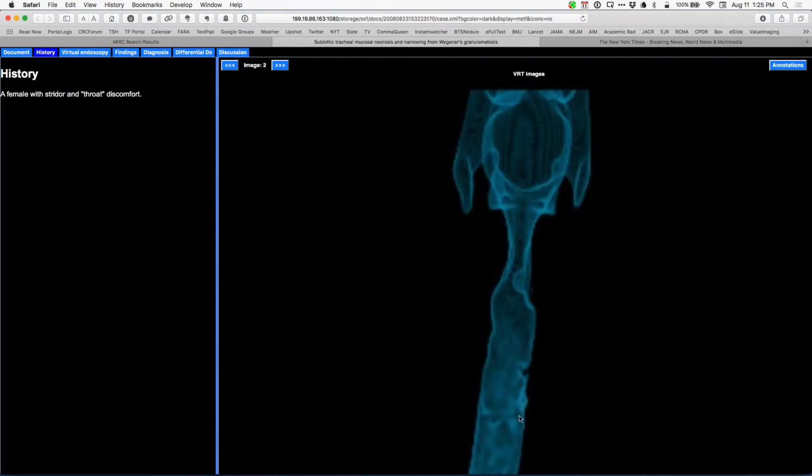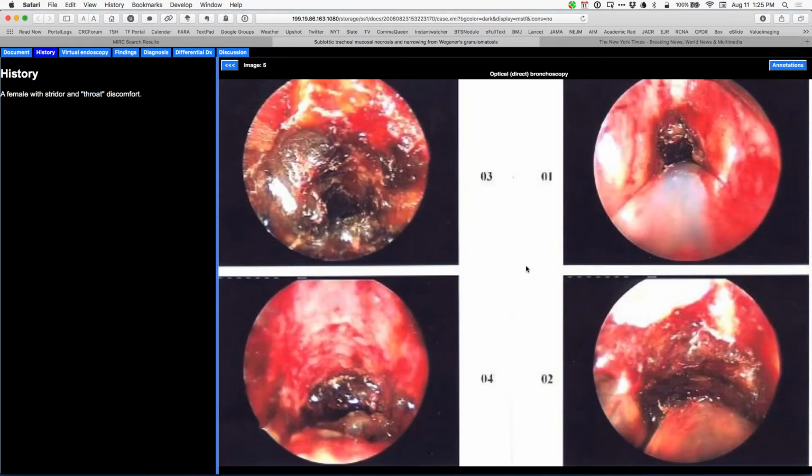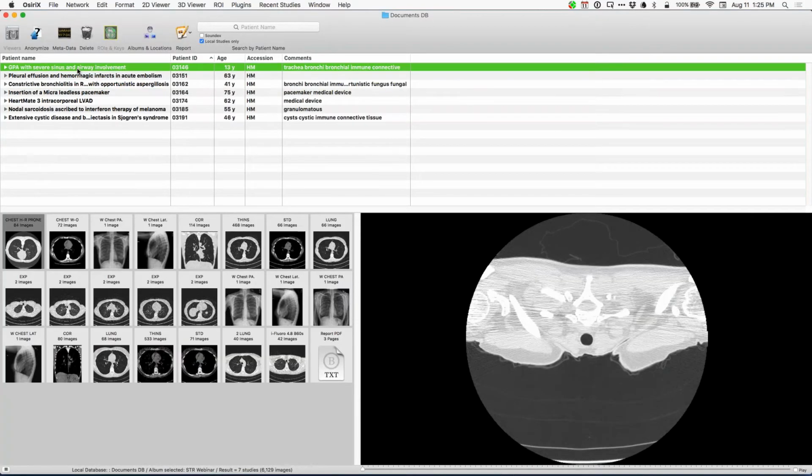So you can see the ulcerations here, what seem to be ulcerations and narrowing and mass-like structures. And on bronchoscopy, this looked quite terrible. This was direct bronchoscopy at the time, showing a tremendous, severe necrotic mucosa of the trachea in that particular person.